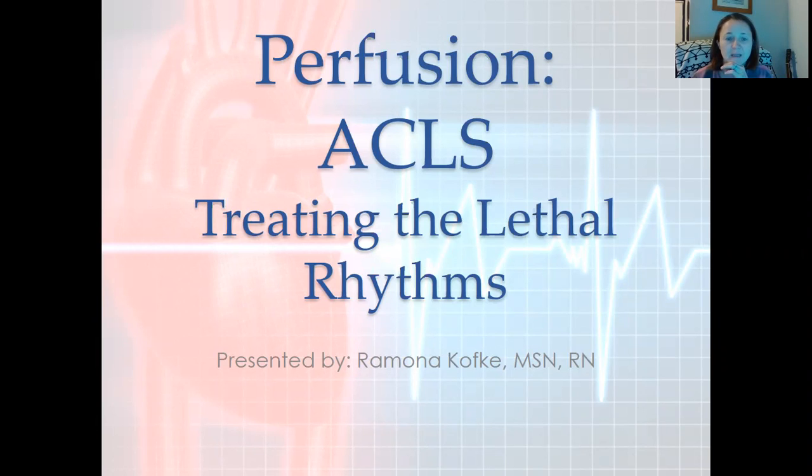We are in the last portion of this dysrhythmia part of your perfusion content for Unit 1. So let's go ahead and get started with this. At this point, we've looked at what's normal on an EKG strip as well as what is abnormal. So now we're going to look at the rhythms that lead to having no pulse.